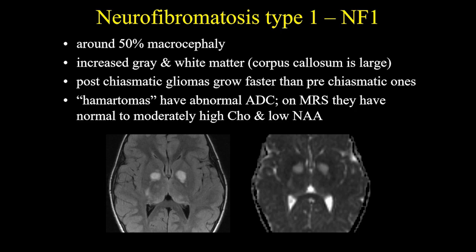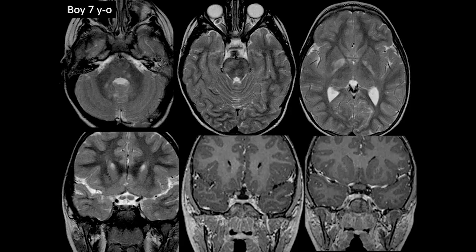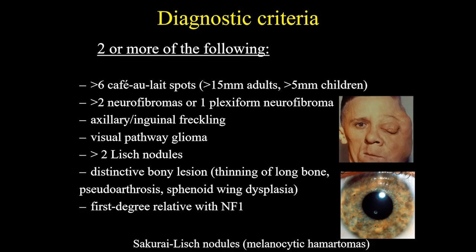Around 50% of patients have macrocephaly, possibly due to increased gray and white matter. Also, you can see that the corpus callosum is enlarged in these patients. Post-chiasmatic gliomas grow faster than pre-chiasmatic ones. Hamartomas have abnormal ADCs, and on spectroscopy they have normal to moderately high choline and low NAA. This is a case of a young boy of 7 years old. He has hamartomas in the brain stem characterized by bright spots on T2, with images also on the globus pallidus and some slight areas of hyperintensity on the thalamus. On the coronal view, you can see enlargement of the optic nerves and also the chiasm, corresponding to gliomas of the visual pathway.